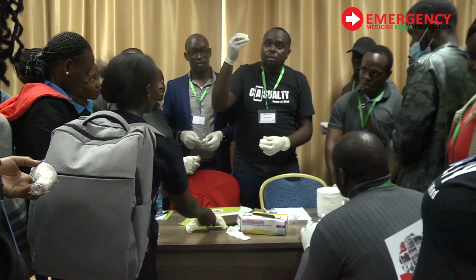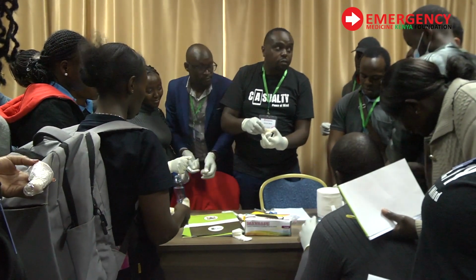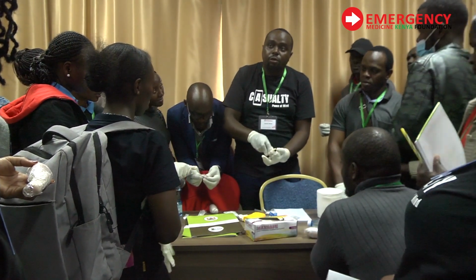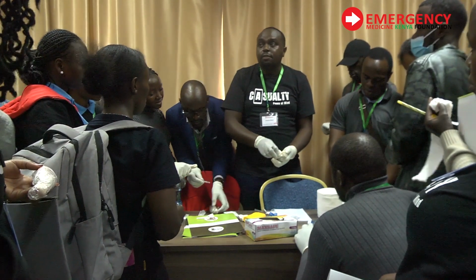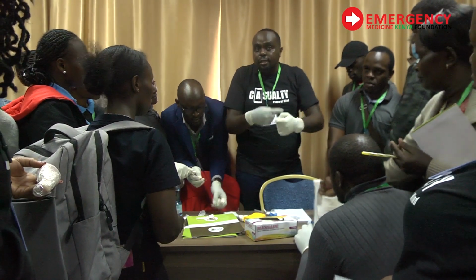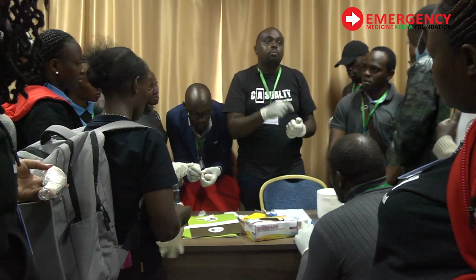They are called cord clamps. So the easiest thing is to just go where you have secured it and clamp it, pressing down so that it gives you the force to hold it next to the bone. So you clamp with a cord clamp. That's the first way. If you are not able to use a cord clamp, you can take the strapping and strap it to the leg, around and to the leg, just to support it there.